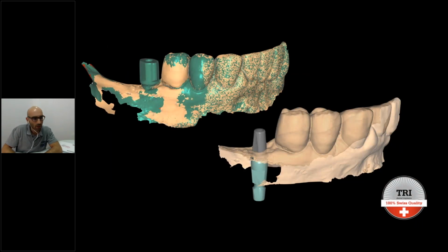Here, the dentist sent us the half impression, because it's only one single crown. As you can see on the left side, these images are green and yellow, which means the impression with the scan body and the impression without are matched together to get the right position through the matching with the library on the scan body. When this match is correct, through the best fit, but I will talk a little bit more about it later.